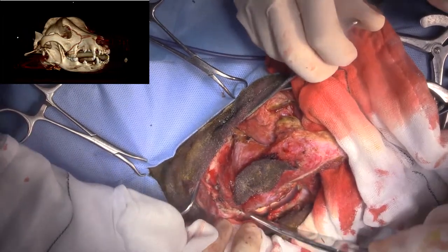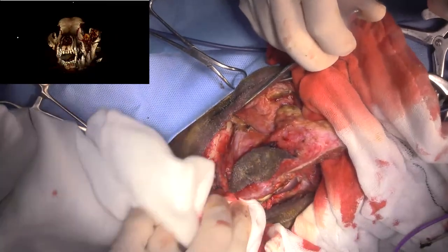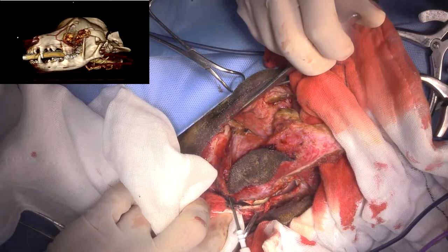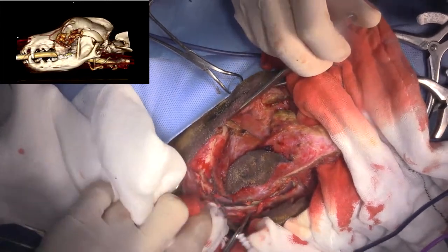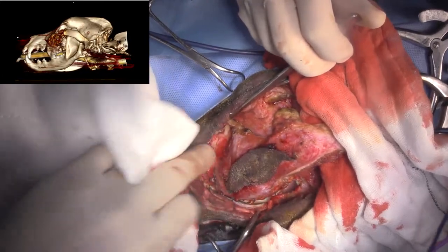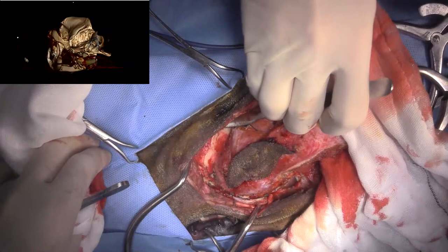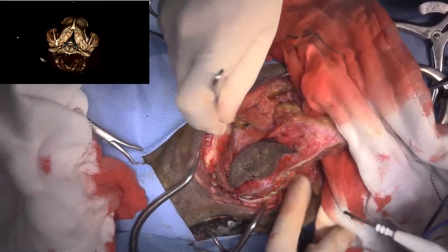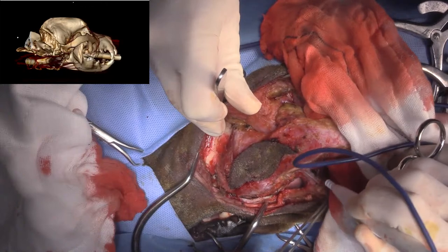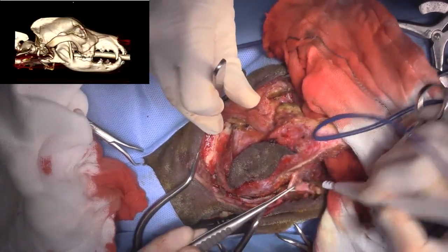So that's a good point, and that's raised an issue. There was a publication at CSU where they did a combined intraoral and dorsolateral approach for the combined orbitectomy, partial maxillectomy in dogs, and found that they gave them good exposure. I've just never really felt like I needed that. And if you look at the exposure that we've got here, it's pretty good. We may have to do a little bit of an intraoral component. Nice big vessel here.